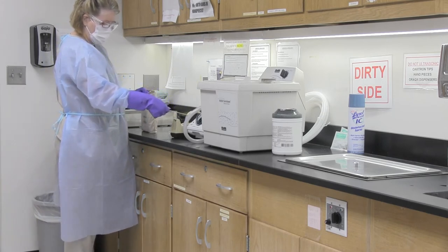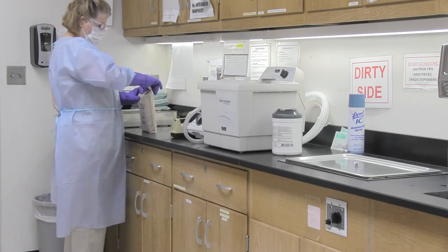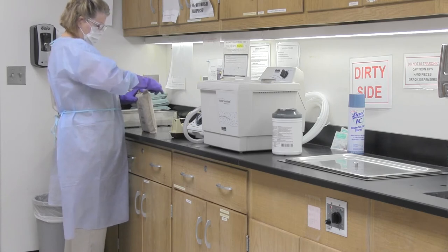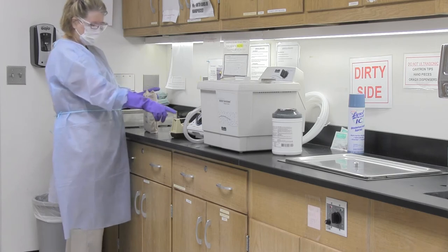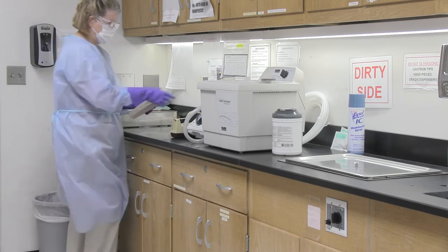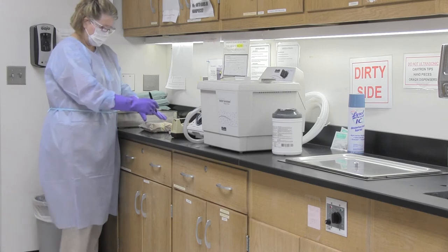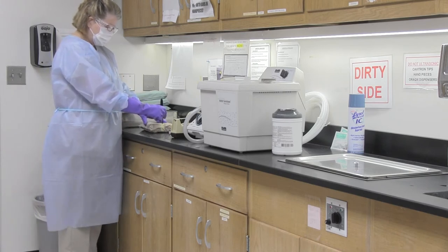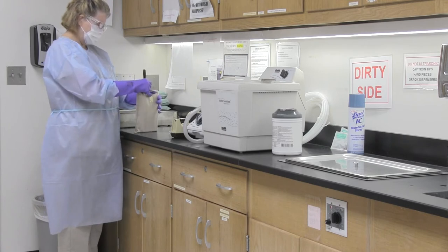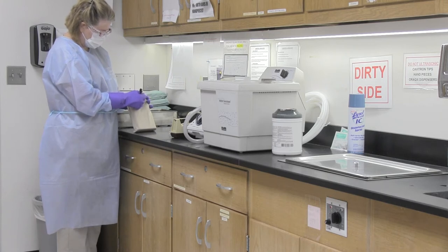With a marker from the dirty side, write the autoclave number, date, and your initials on the autoclave tape. The autoclave tape has brown hatch marks on it — this is also a monitor for steam. I am going to write A1 because that is the autoclave we are going to be using, then the date and my initials.